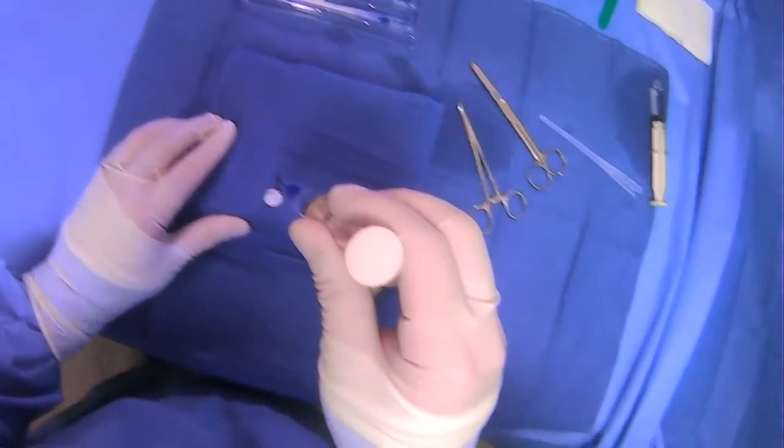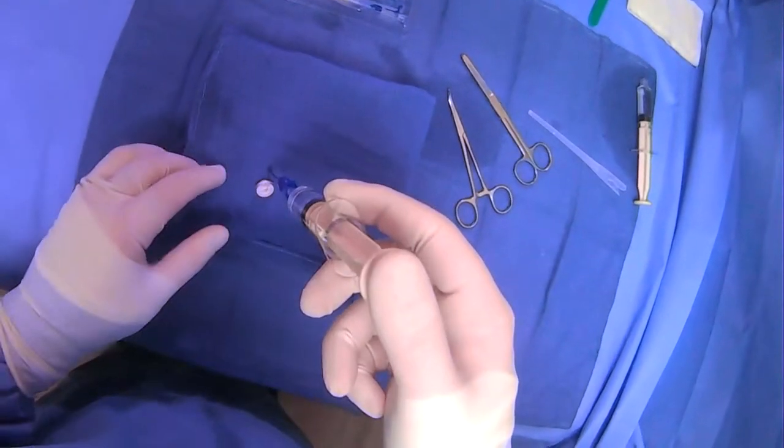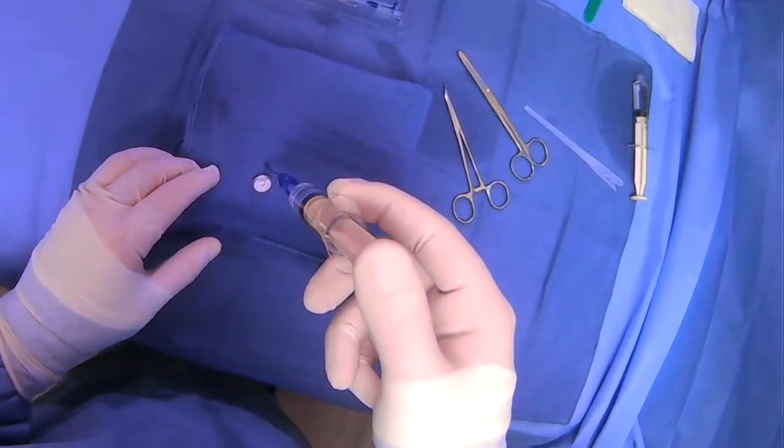We will pull back, see air, then we'll inject a little bit of contrast to make sure that we're in the right place.